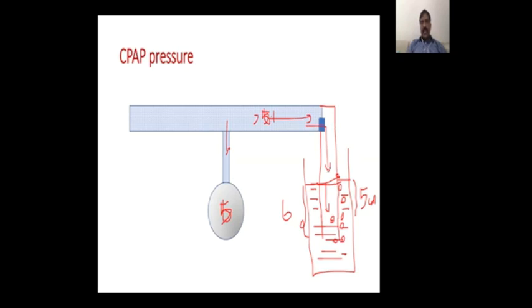So to ensure that the pressure is there in the tube and pressure is there in the lung, we can push this inside, or to decrease the pressure, we can pull this tube out, so that the pressure in the tube, the circuit and the lungs decreases. So this is how we generate pressure when you're using bubble CPAP. So the concept is very clear.